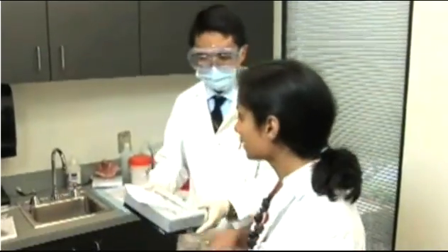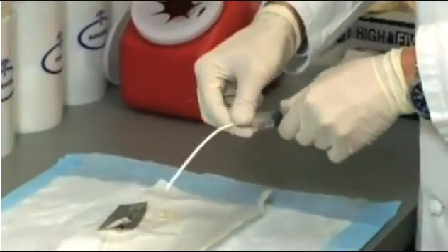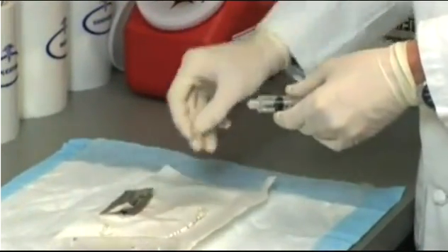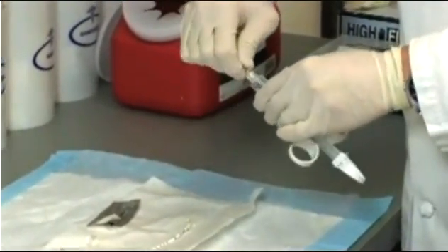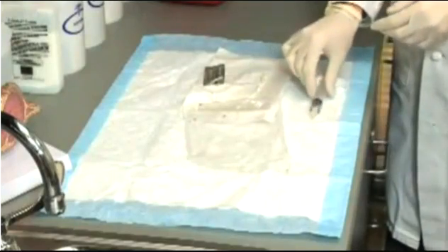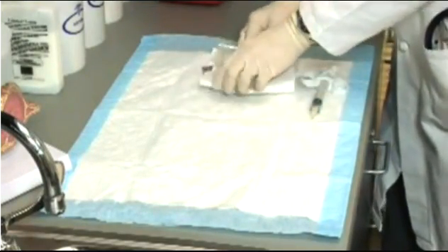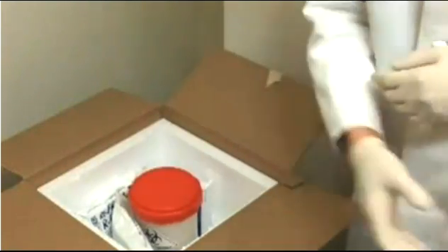Offer the patient a tissue if necessary. Detach the tube from the syringe. Tightly screw the syringe cap onto the syringe to contain the specimen during transport. Then dispose of the used equipment according to biohazard waste disposal guidelines. Transport the aspirate specimen to the lab in the capped syringe using cold packs to maintain the specimen at four to eight degrees Celsius. Do not freeze the specimen in the syringe.